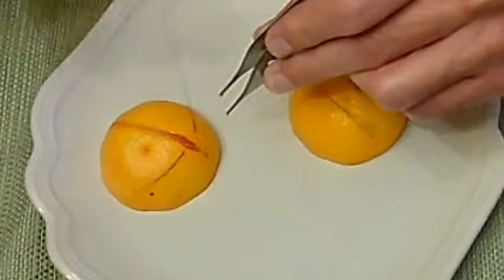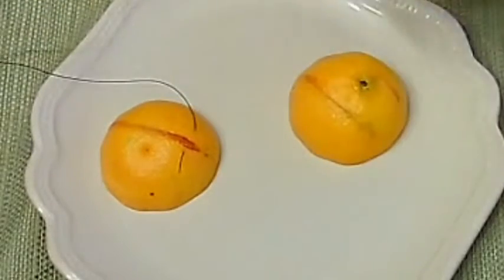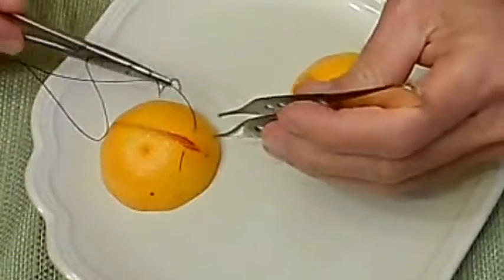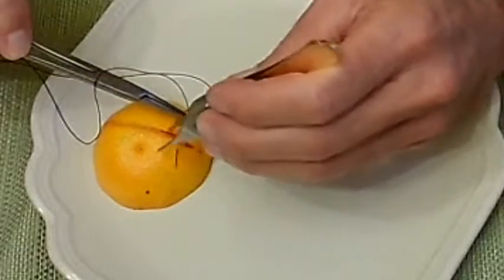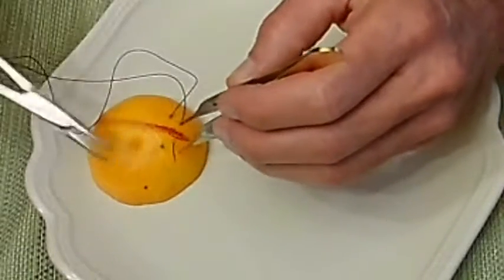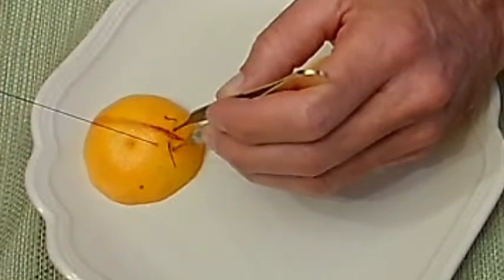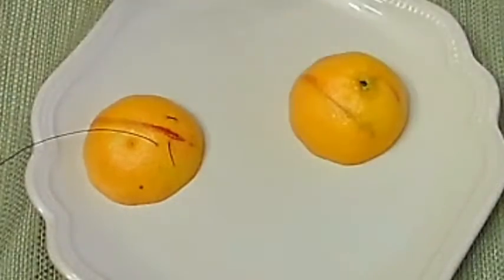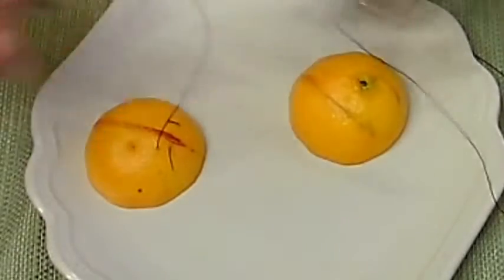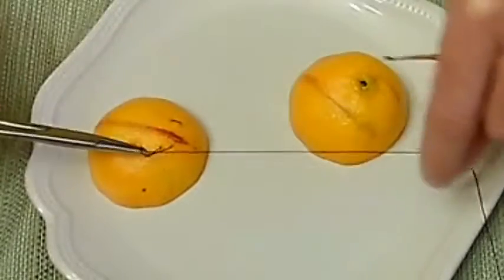It just means that you go in and out one side, and out and in from the other. I put a little magic marker along the cut in the orange this time to accentuate it. It's still very hard to manipulate orange-like skin, but I'll do the best I can. In one side — it tends to evert the skin edges when you use this suture, so it's nice and thick skin.